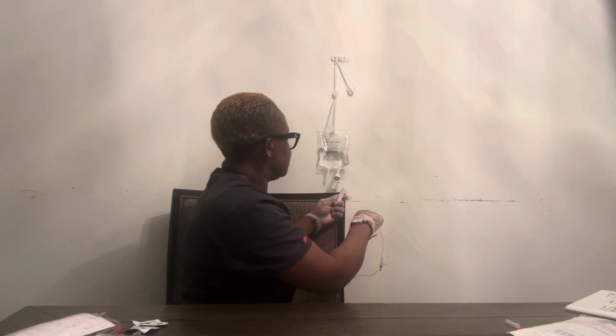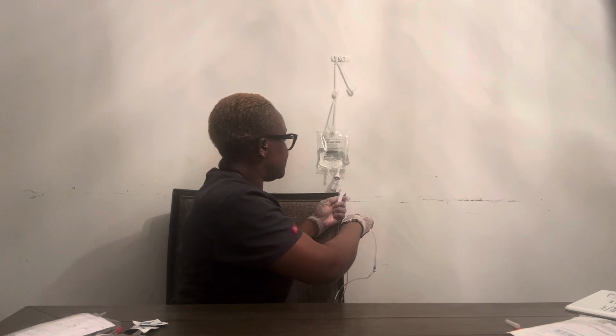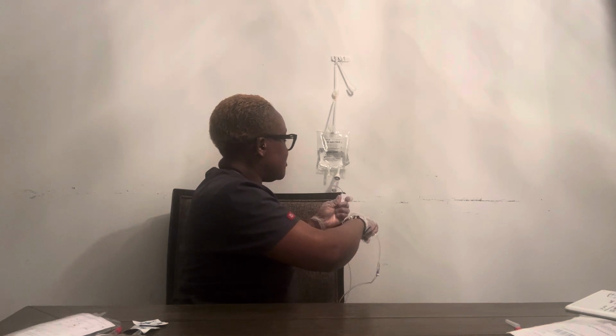Okay, so I'm gonna go ahead, I'm gonna open my roller clamp. I'm gonna slowly open it. Okay, and then I am gonna go ahead and count for 1 full minute.